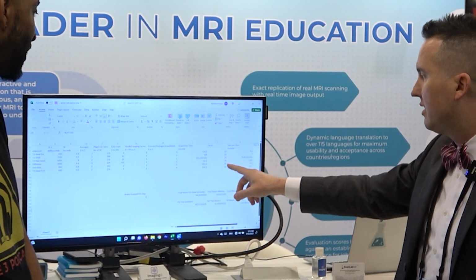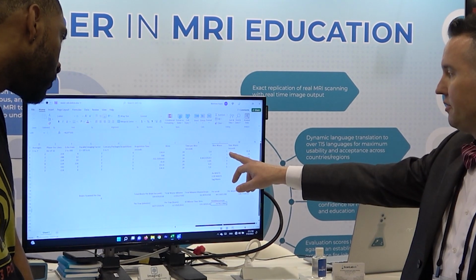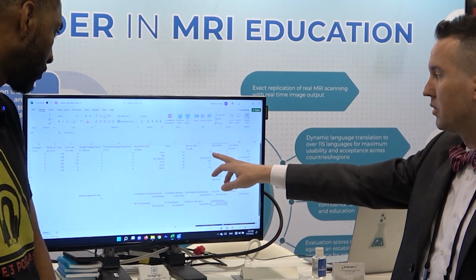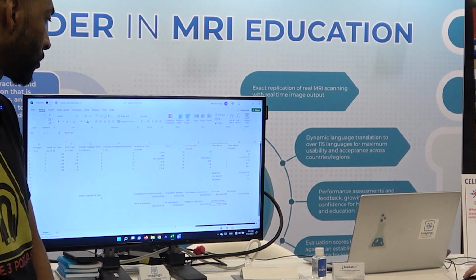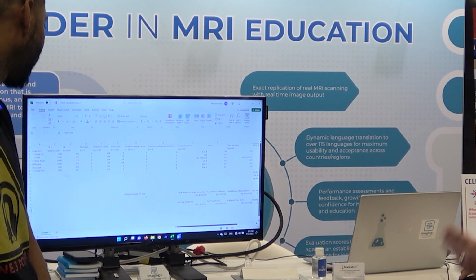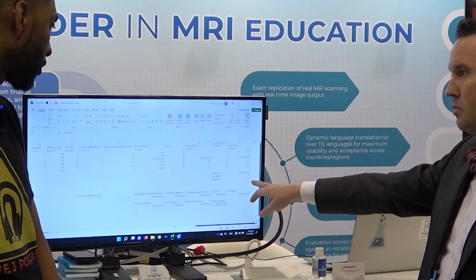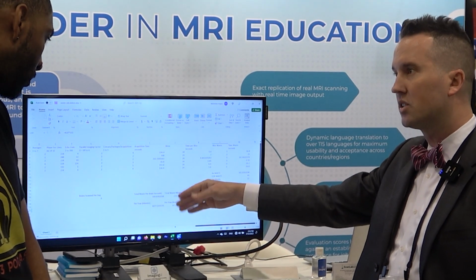So now I can see that in this case, this person has 3 slices too many on all axials, and this is real data. Oh wow! So every single time. So now I can tell per slice that's 5.6 seconds. Because on your brain you have different axial slices, we can reverse engineer how much every single slice costs you. So at the end of the day, this person was costing us total wasted time per brain of 169 seconds, 3 minutes.